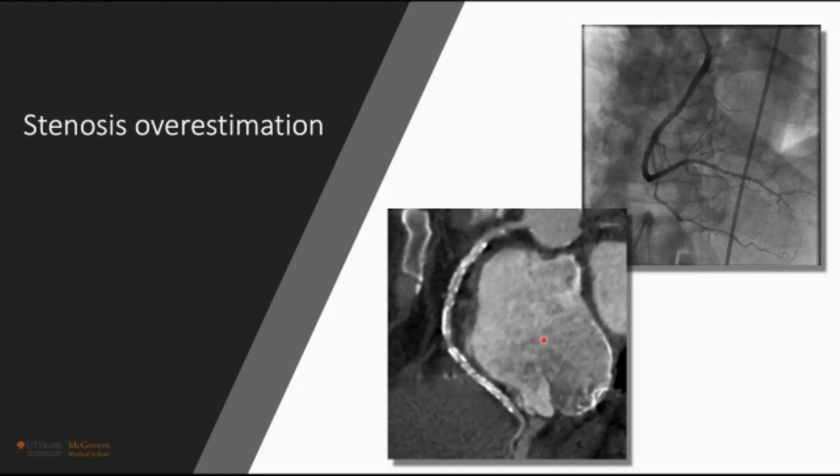What were you thinking? In my invasive angio, my vessel looks perfect or nearly perfect. Why did you send this patient to the cardiac cath? This problem still remains. Hopefully the spectral imaging is going to change that as well.